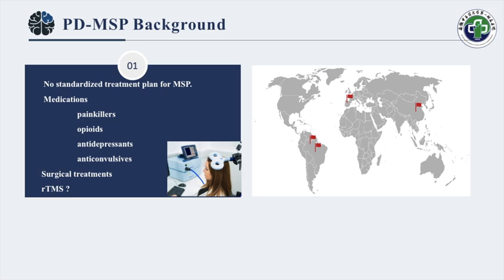As we know, repetitive transcranial magnetic stimulation, rTMS, is a non-invasive neuromodulation technique that involves delivering repetitive magnetic pulses to a specific brain area over a short period of time through a stimulation coil placed over the scalp. The repetitive magnetic pulses alter the excitability of the stimulation site and also influence brain regions anatomically connected to it. Because rTMS alters neural activity and its behavioral effects can persist after stimulation, this technique has generated much interest as a potential therapy for various neurologic and psychiatric disorders.